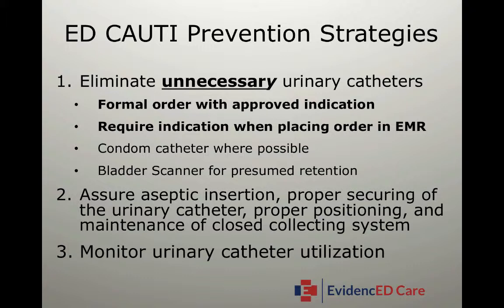There are three major strategies for reducing CAUTIs in the emergency department. First really would be eliminating unnecessary urinary catheters when possible.